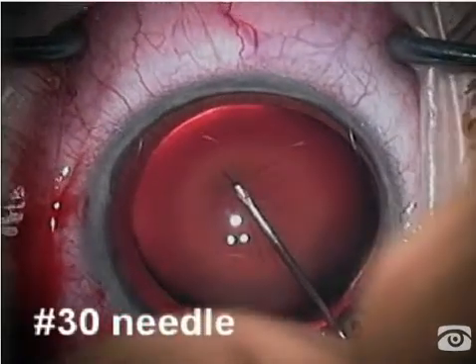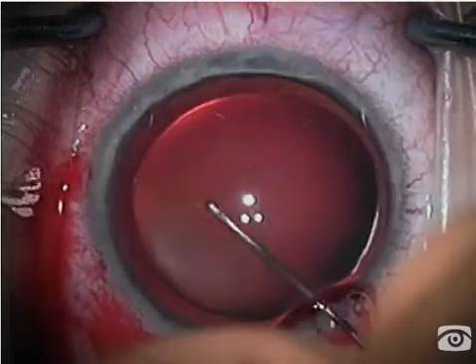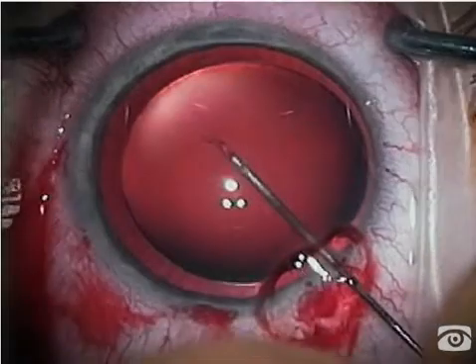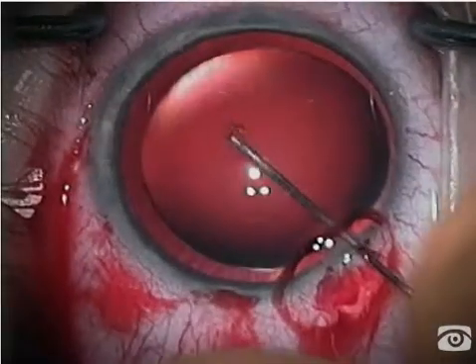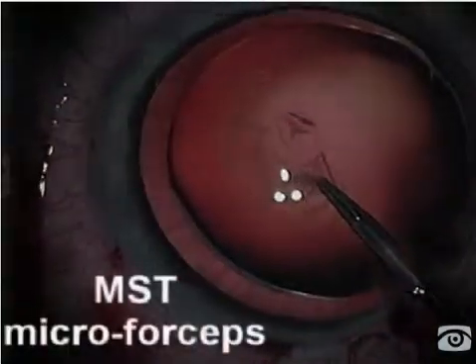The anterior capsule is very difficult to incise because of the lack of zonular tension peripherally, so it's very pliant, and even though I'm using a 30-gauge needle, I still have difficulty initiating the tear.